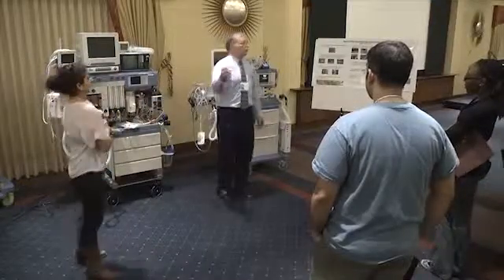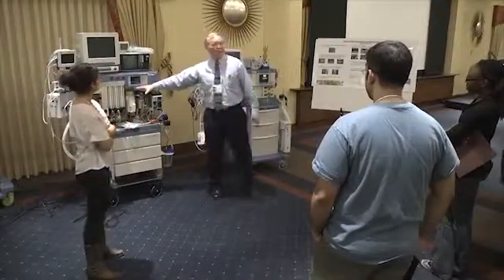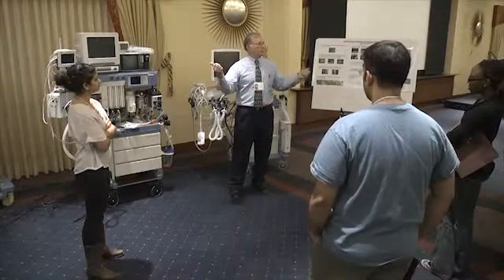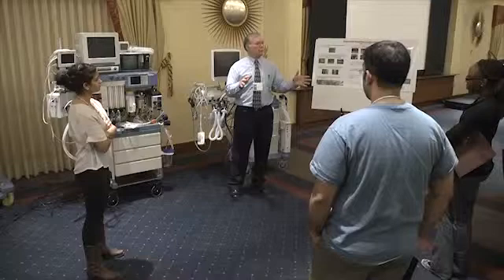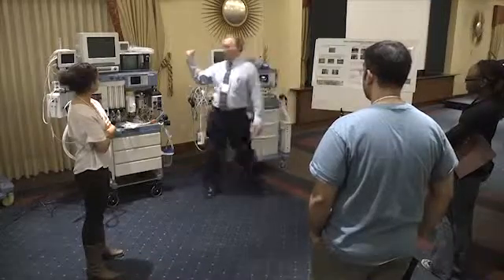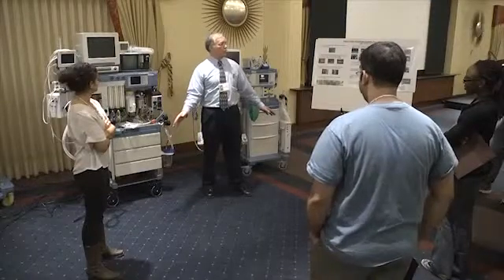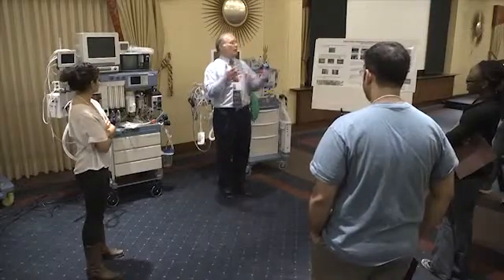And if I was to shut off your vacuum so that you're putting out 10 and there's 0 sucking out, it goes into the room. All right? That's probably the biggest thing that you should remember. So if I shut off your oxygen, or shut off your vacuum, you're going to pollute the room. All right? But at least you don't do a blow up of your patient's lungs.